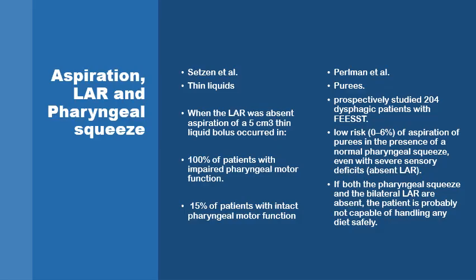By integrating the information gained so far from testing for the laryngeal adductor reflex, which reflects the integrity of the superior laryngeal nerve, and the pharyngeal squeeze maneuver, which is a rough guide to the contractility of the pharyngeal muscles, some important decisions can be taken, even before starting the patient on any colored food and drink.